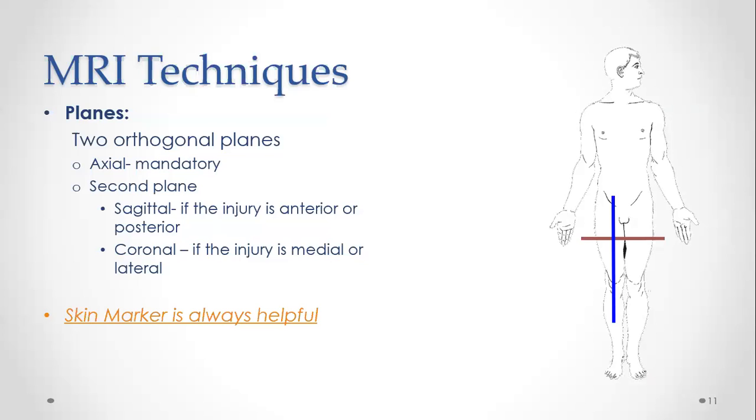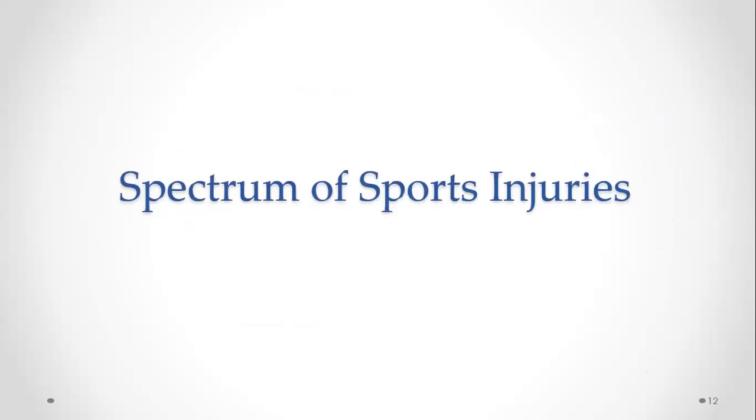It's also vital that you remind the MRI technologist to place a marker where the pathology is. And this is quite important if you are dealing with an old injury. Because dealing with acute injuries is much easier than dealing with an old injury, because with old injury, we don't really see soft tissue fluid.